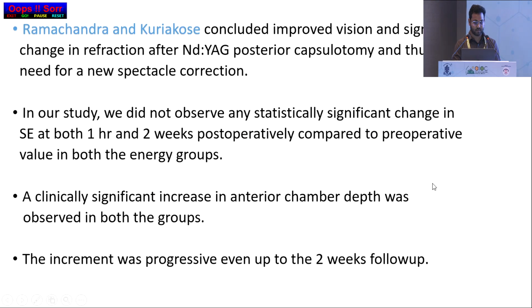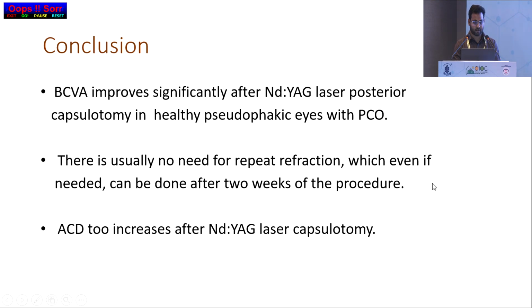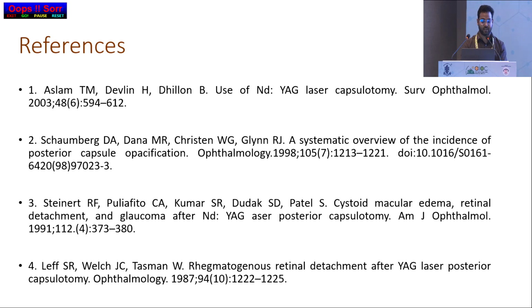Conclusion. The best corrected visual acuity improved significantly after the Nd:YAG laser posterior capsulotomy in healthy pseudophakic eyes with PCO. There is usually no need to repeat refraction. AC depth also increases after the Nd:YAG laser capsulotomy. These are my references. Thank you.